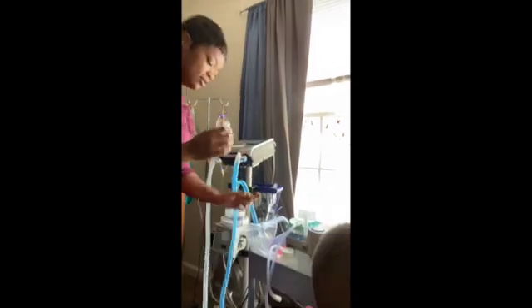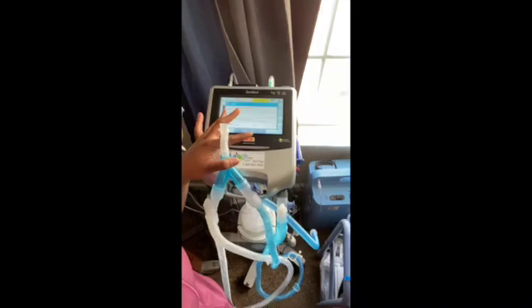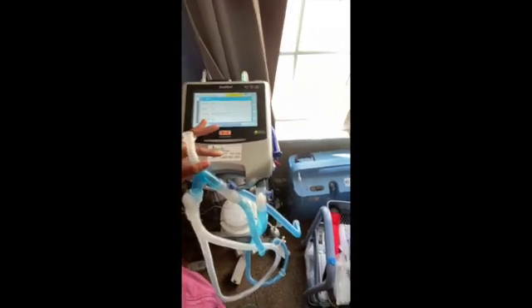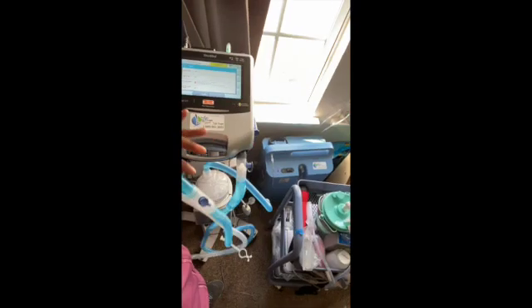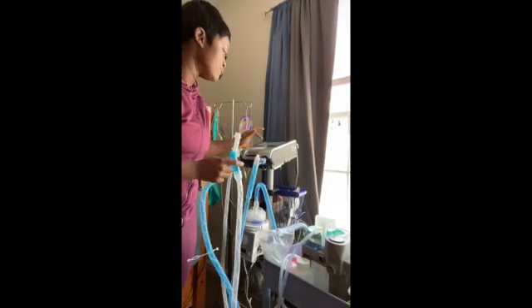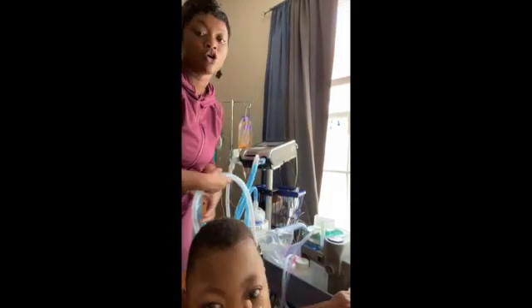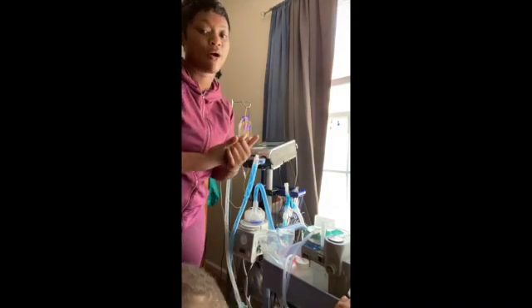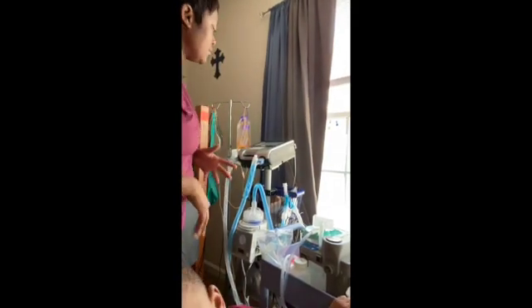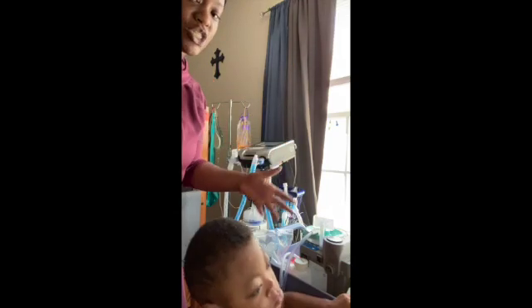As you can see, it's the same thing I showed you earlier: learn circuit check, device test check, expiratory flow sensor check. The only thing with a red X is the oxygen sensor, and it's okay because he does not use oxygen 24/7 — he breathes room air. The learn circuit is actually complete, and this is where you would confirm, start the vent, and connect your child back on the vent. Braylon is doing his trach collar trial, but normally you want to make sure you're bagging your child — it takes two sets of hands. You need somebody bagging your child while you do the learn circuit on the vent. If you have any questions, feel free to comment, and thank you so much for watching. I hope this video helps you.